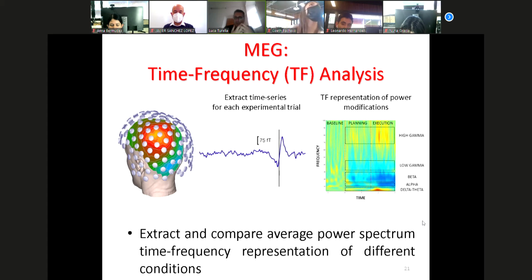I think it's always important that before knowing how you get the signal, as you already know EEG, it's good to understand what you can do with this data, okay? And for me, the first time I saw this kind of representation, as before I was using just fMRI, it was amazing how much information was captured by these techniques, something that before I couldn't see with fMRI.